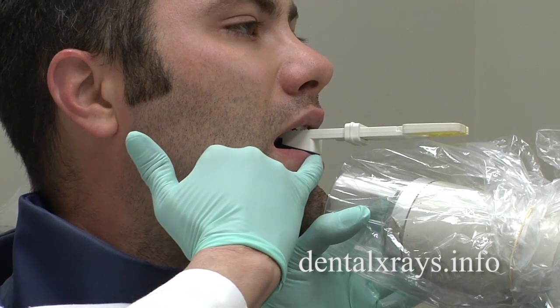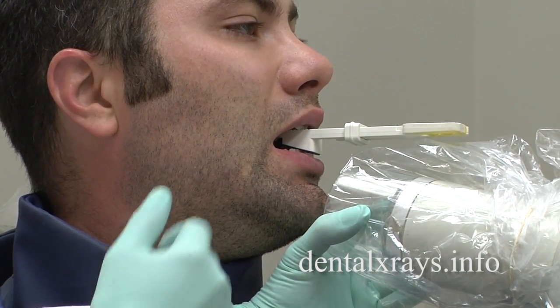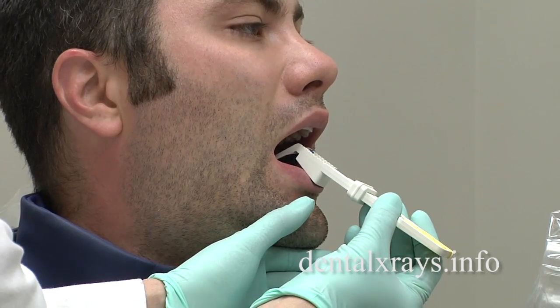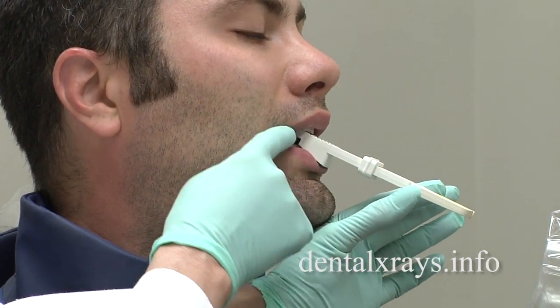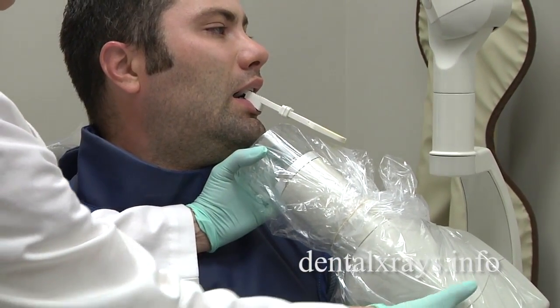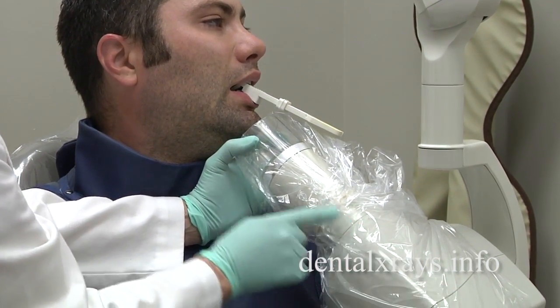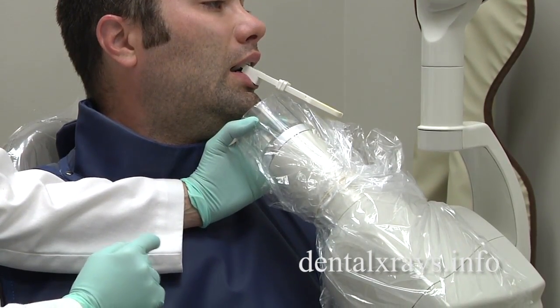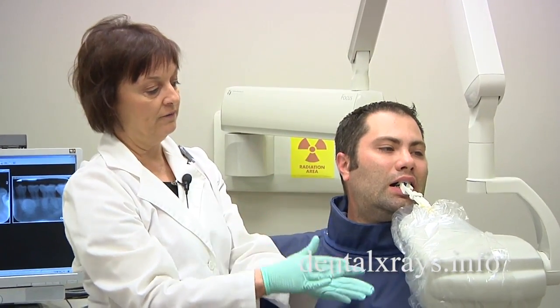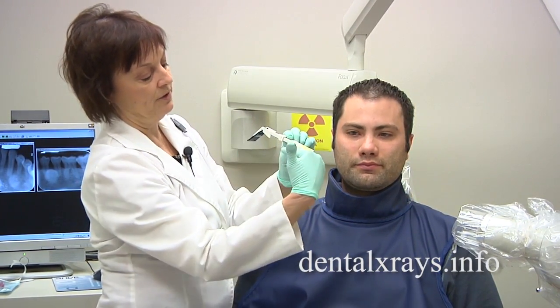Just make sure the top edge of the cone is covering a little bit above the bottom edge of the bite block so you're not going to cone cut the occlusal surface of the teeth. If the film is in the mouth at a different angle — let's say it was flatter — you can see that the angle is even more severe. In that case, you're going to have to increase your vertical tube angle upward to compensate for the film being flatter in the mouth. So always follow the position of the bite block with your tube and you shouldn't have any problem.